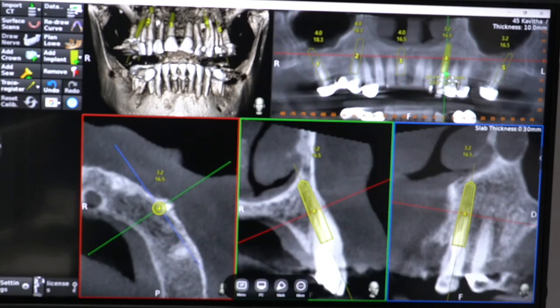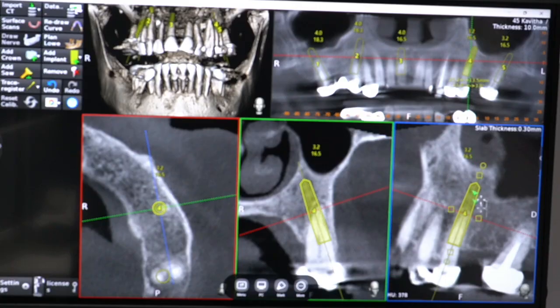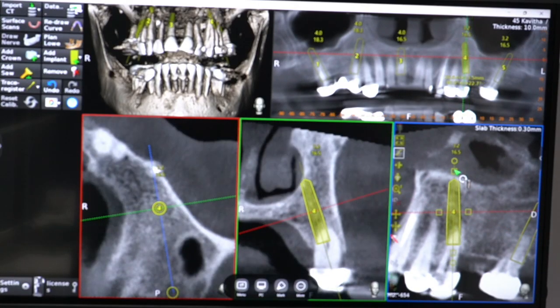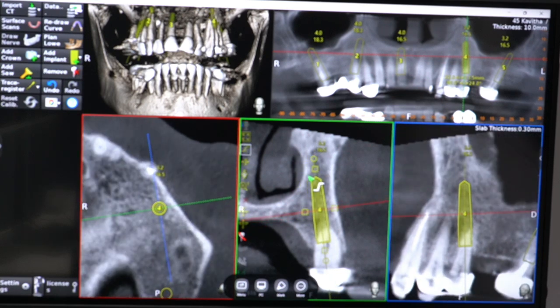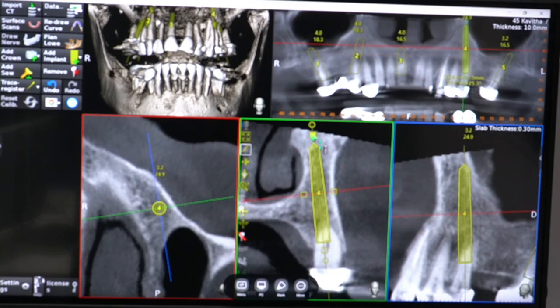So the right tilted implant is over. It's a straightforward situation. On the left, we will start from the second premolar and tilt it mesially, and we will stay along the buccal wall. So if you see here, there is one interesting thing: if you drill, you may not feel any dip.